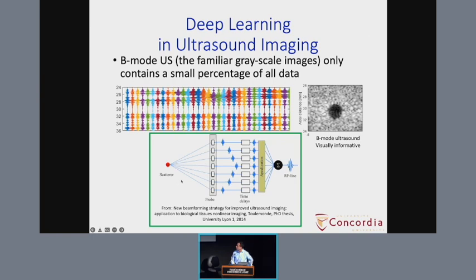So normally what is done is, ultrasound consists of many piezoelectric crystals here. We get channel data from each one of them. We apply some time delays that account for the time difference between different paths to different crystals. And then we apply some apodization window to average these up, right? And then we get the RF data, and from RF data, we calculate the ultrasound image, right? So this is not data-driven at all. No matter what the data is, we apply the same delay and beamforming.